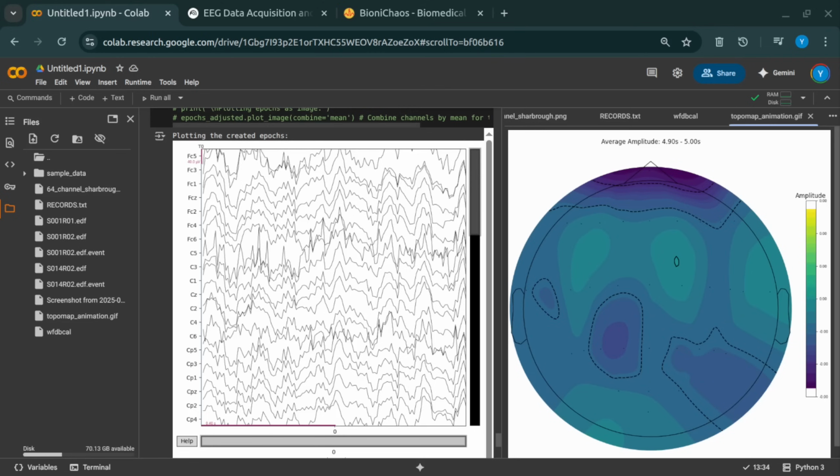Okay, so loop through time, make a plot for each tiny step, stitch them together. Sounds straightforward enough, but I bet there were some last-minute coding hurdles, weren't there? Oh, you know it. The nitty-gritty that makes it all work, that often surprises you right before the finish line, because that's the reality of working with complex data. Yeah. It's rarely a straight line.